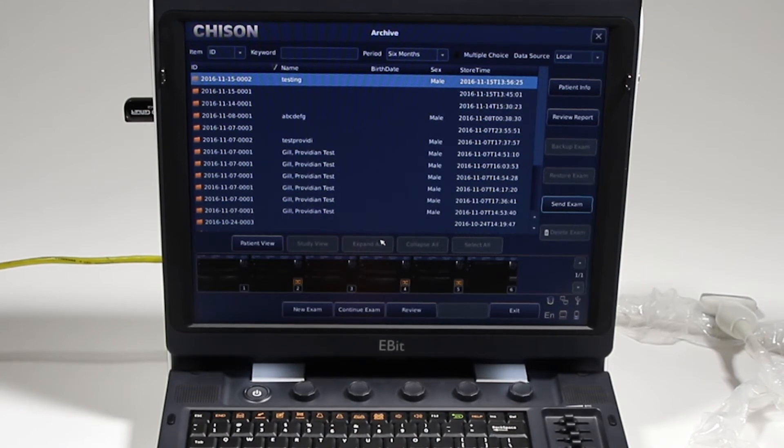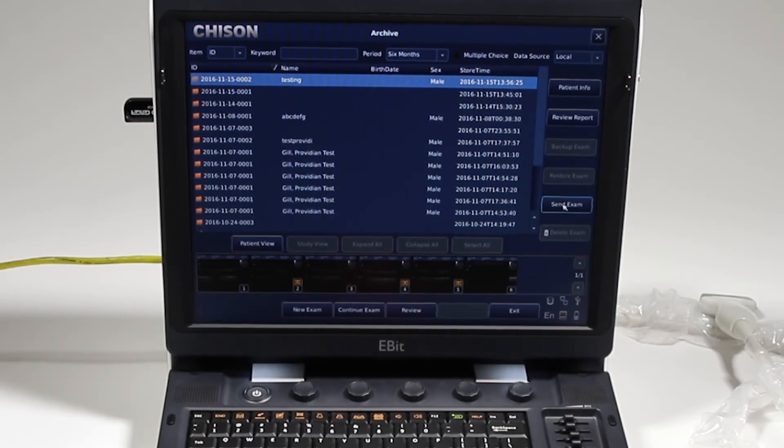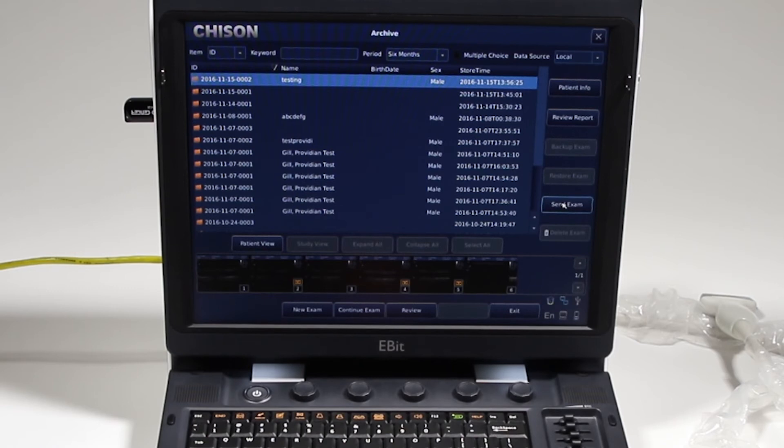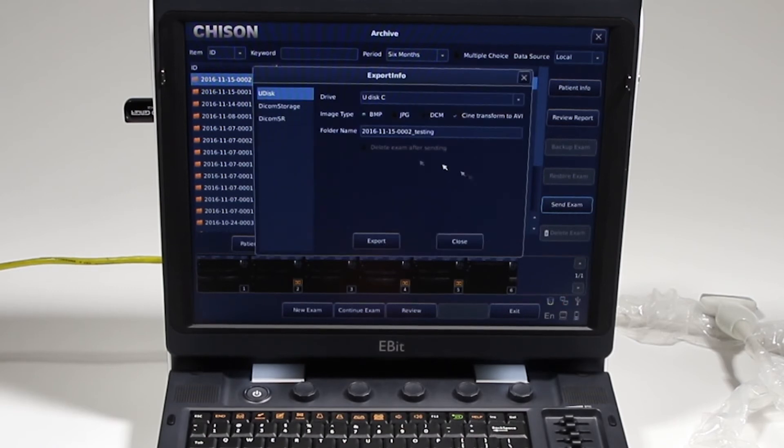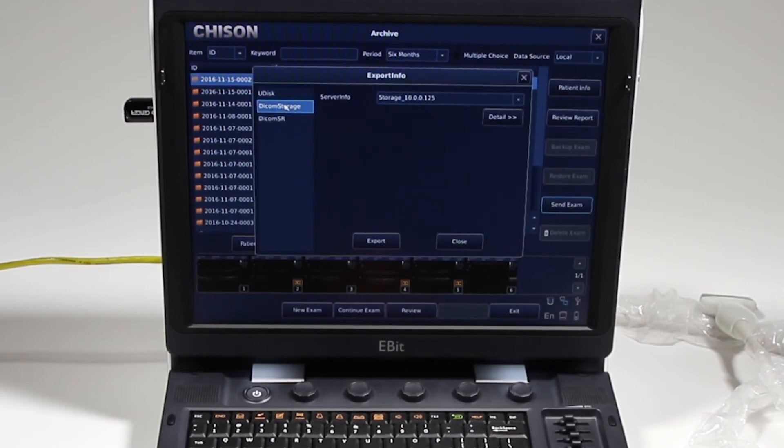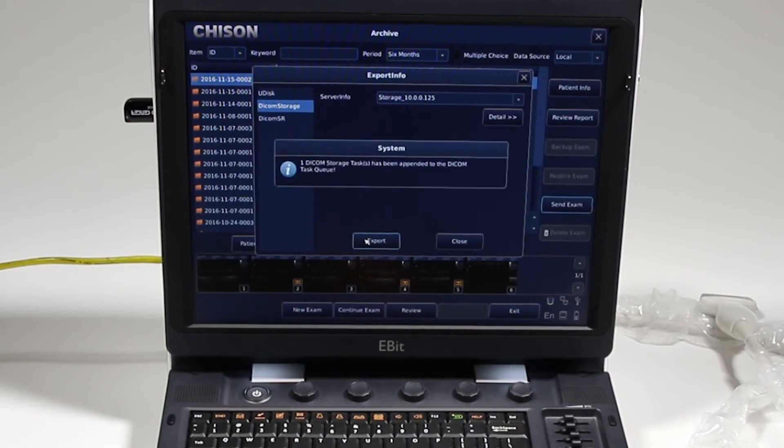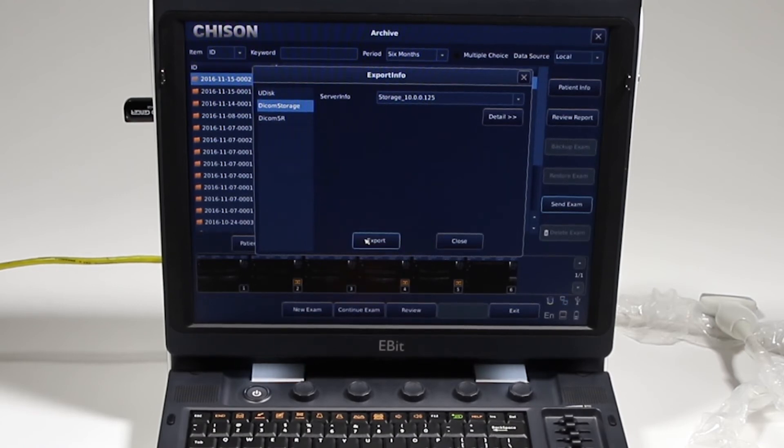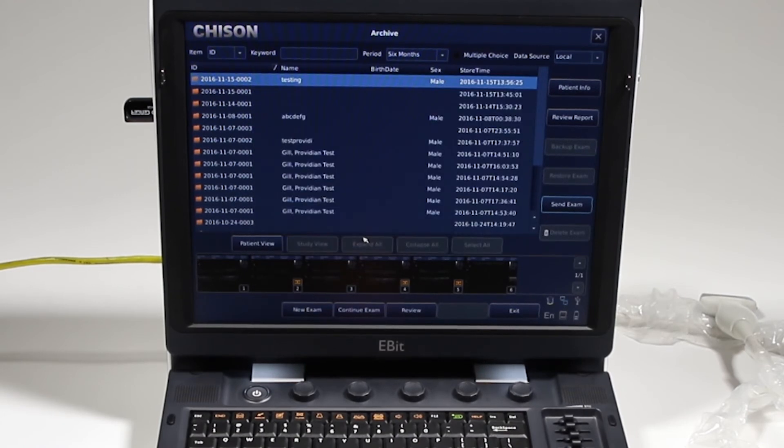Now, if I want to export that to DICOM, I can click send exam, and I'll show the DICOM setup here in a minute, but I can choose my DICOM storage, and there's my DICOM server. I'll click export, and it shows that it's in the queue.